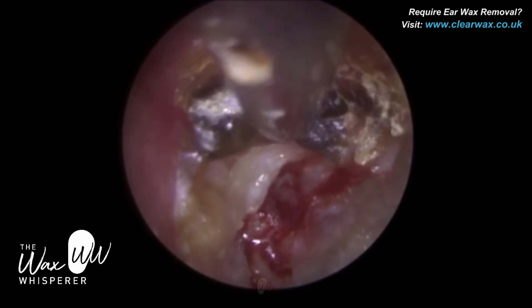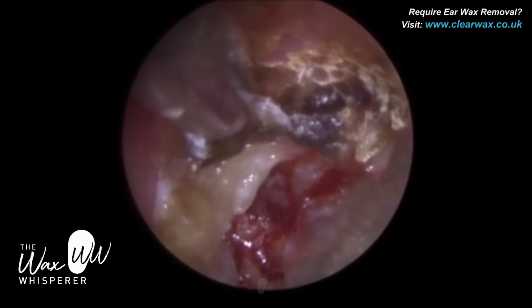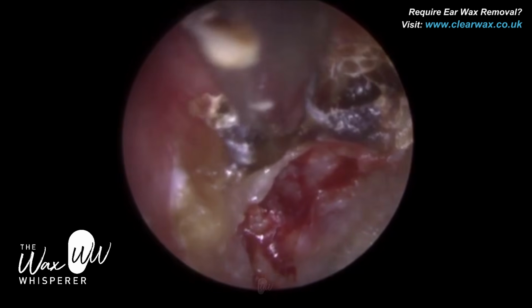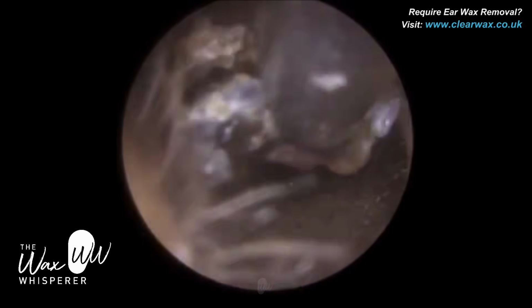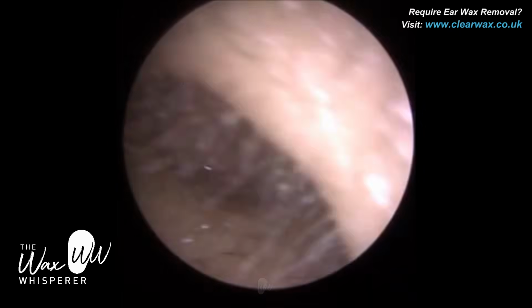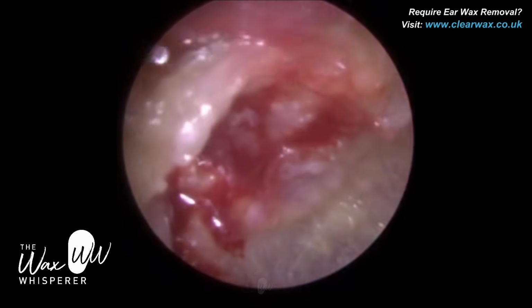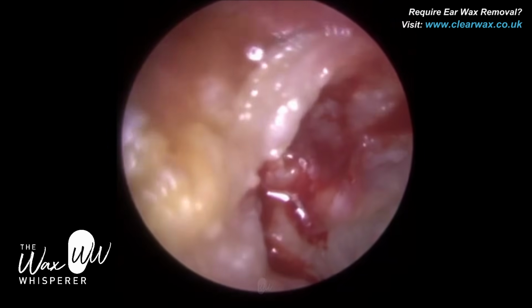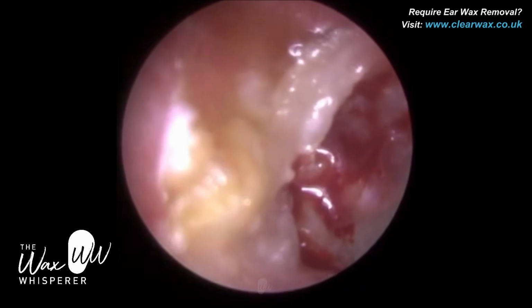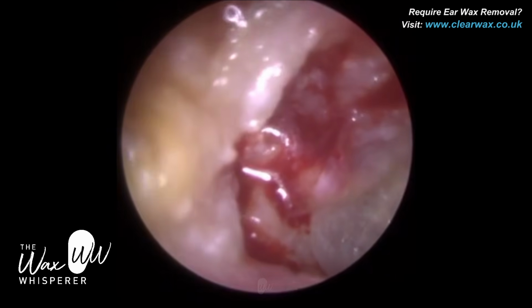That would need to be done under general anaesthetic, under surgery. So I'm just delicately feeling this, just getting a feel of it. Is it in the middle ear? And fortunately not, it just peeled away. And you'll see in a moment, the top part, that's where all that red, the inflammation, that's where the eardrum sucked in, and that's a retraction pocket. That's where that plug of dead skin was collecting inside that retraction pocket.